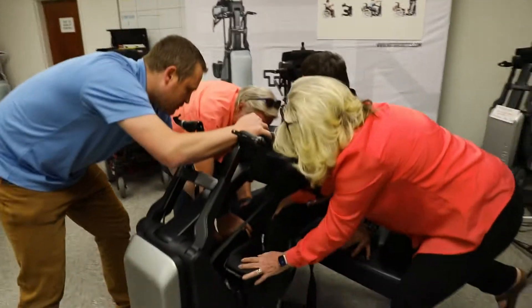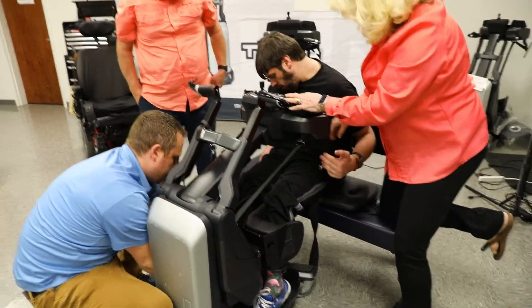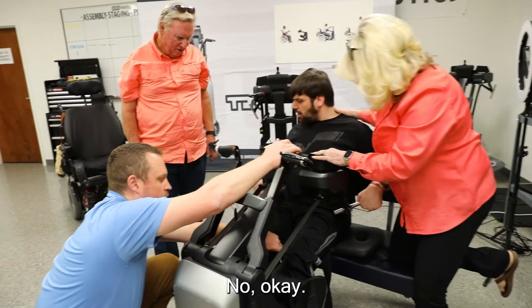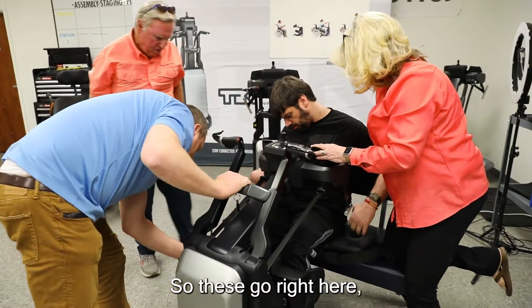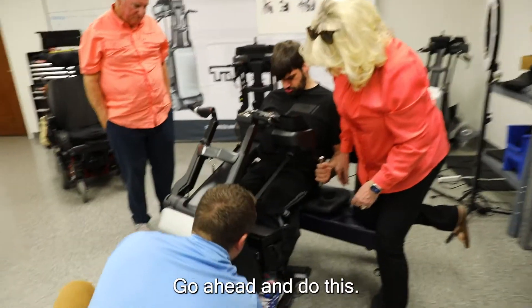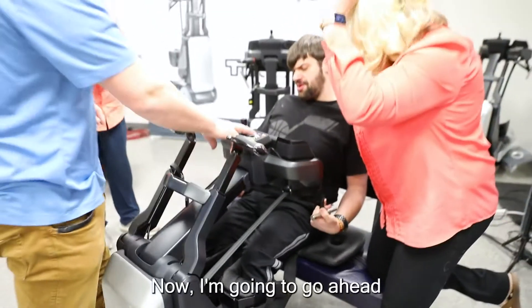Let's get your knees separated. Does that feel okay? Not causing any pain or anything? These go right here and they'll help keep the cushion in place. This goes across the toes, just keeps them from lifting up.